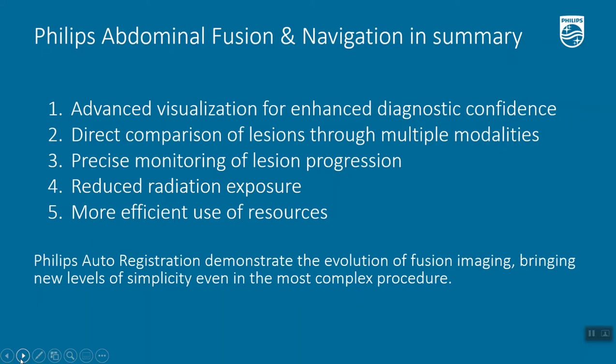Philips auto registration demonstrates the evolution of fusion imaging, bringing new levels of simplicity even in the most complex procedures.